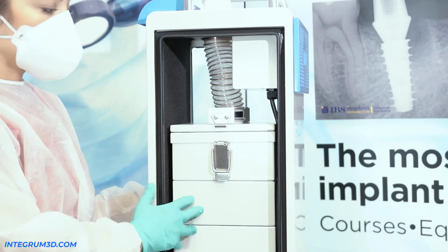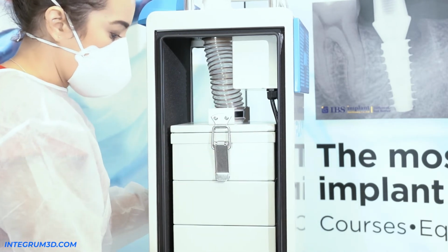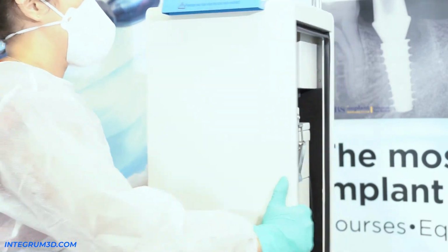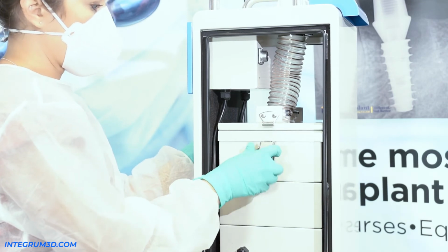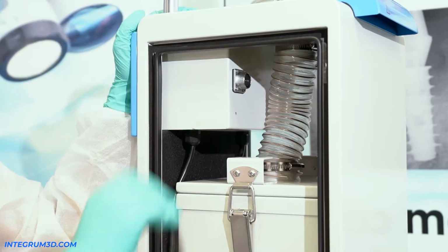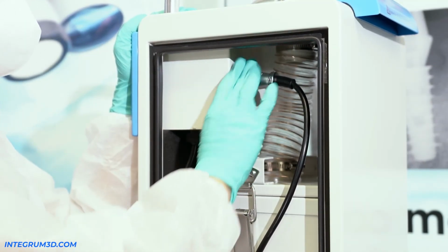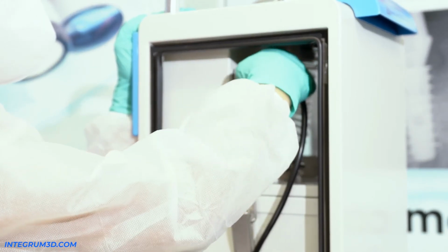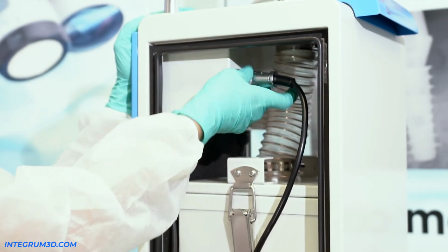Before putting the panels on, let's put all the latches back just the way they were, all the way down, and we'll do the back side. There we go. We're going to put the power cord back on and turn it all the way back down, just the way you got it, so it doesn't turn anymore. Just like that.